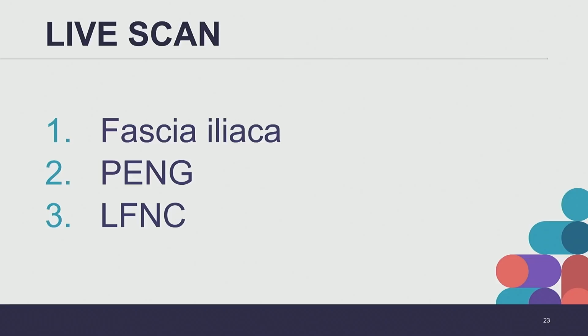If you can see that, then from there you can see some of the other structures aligned with that AIIS, which is the pinch of that bow tie. But if you're having a hard time finding that, and it would be easier for the patient to hold their pannus up and for you to just pop it right in that classic infrainguinal approach, that's a lot better than not doing a block. So whatever you feel comfortable doing, as long as some local gets under the fascia iliaca, whether it's supra or infrainguinal, you're doing them a good service.